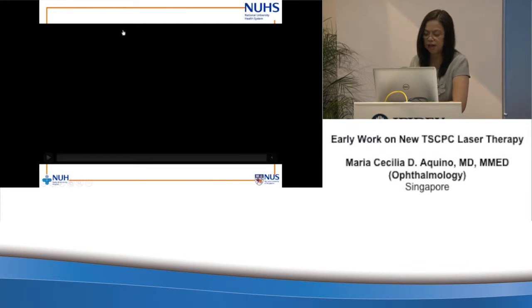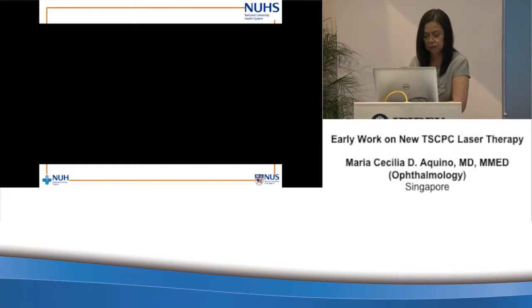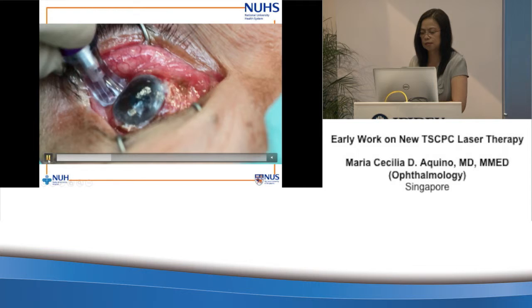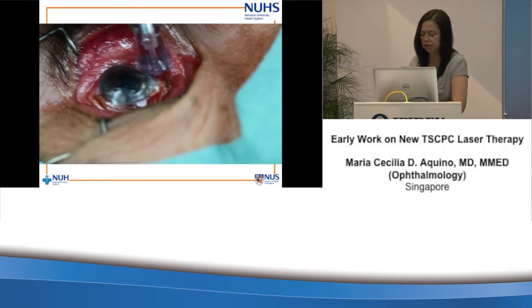you can see that this eye is very chemotic. You can still easily slide it without being hampered by the conjunctiva.